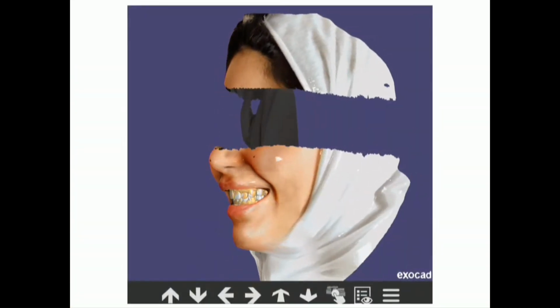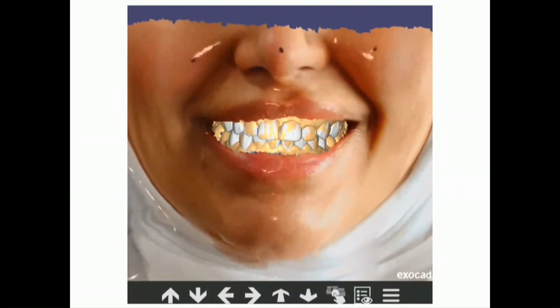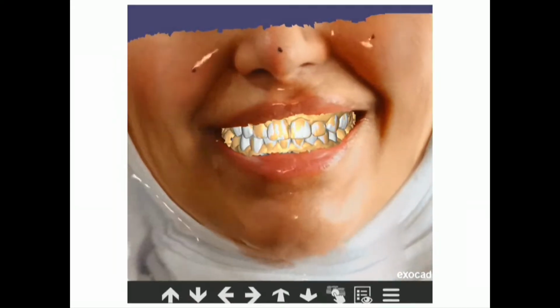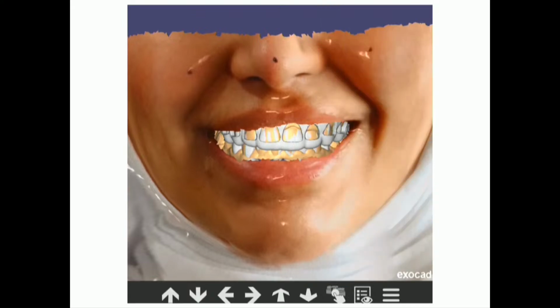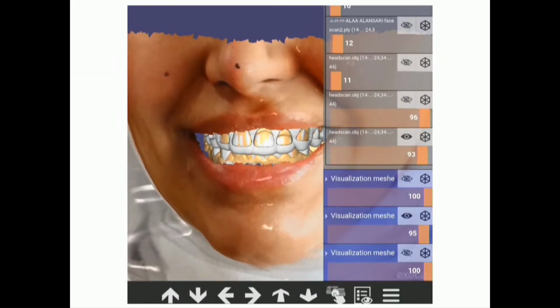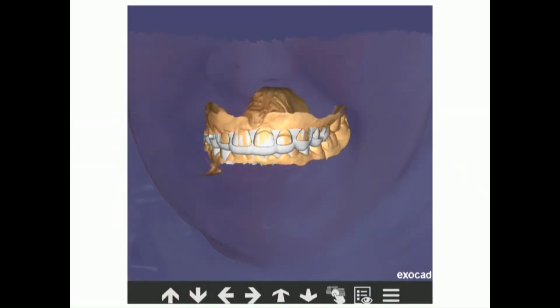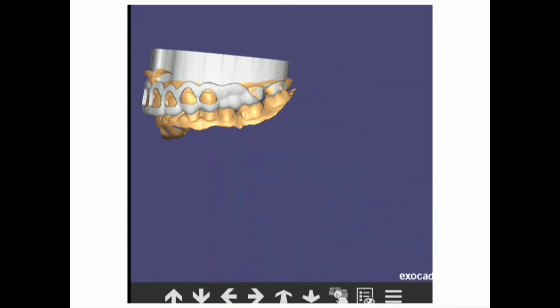And with the guys in Voxel Lab again, we can send them facial scans. You can send them upper and lower impressions or scans. And they can fabricate this kind of surgical guide in a 3D manner. And I can show the patient my surgical guide that I'm proposing for her.